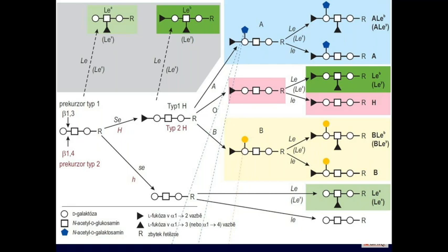So those written with lower case se and h code for the Bombay phenotype.